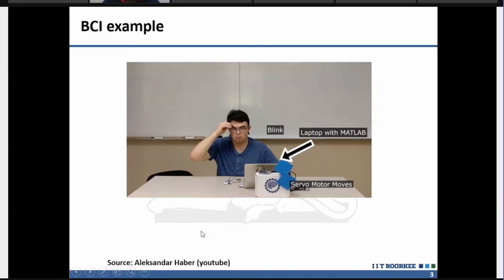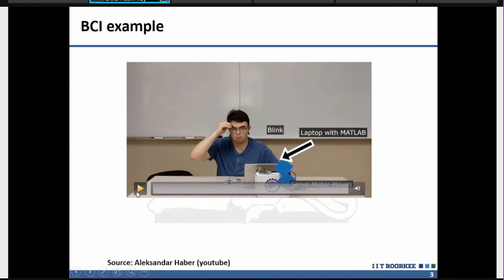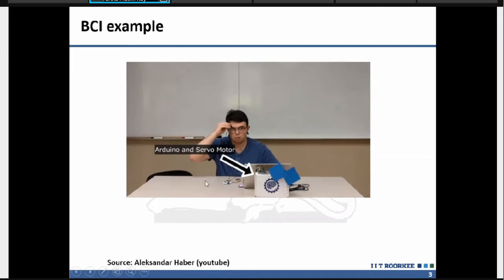For example, it's taken from this YouTube video. This guy is using EEG brain sensors to control a motor. Okay? So there is no camera. What he is doing is blinking the eye. He's blinking the eye.